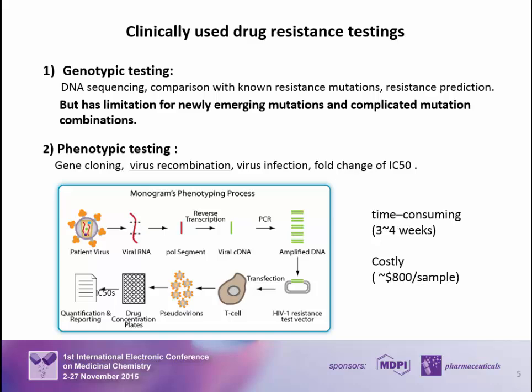Phenotypic testing measures the drug resistance directly. The clinically used phenotypic assay is also called the recombinant virus assay, and this figure shows the phenotyping process of one commercially available kit used in clinic.